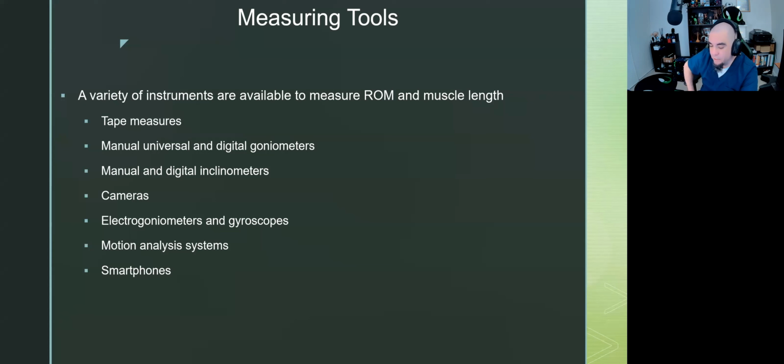I've now seen there's a new system, and I'm trying to see if I can talk. I think it's Patterson that has it, or I don't remember which company it is. But this one company has these really cool, not electrodes, but they're like electrodiodes. If I'm measuring elbow flexion, I can put one of the diodes here, one of the diodes at the elbow, and one of the diodes at the wrist. And if I hold my smartphone and have the patient move through the range of motion, it actually measures their range of motion for me and documents it.